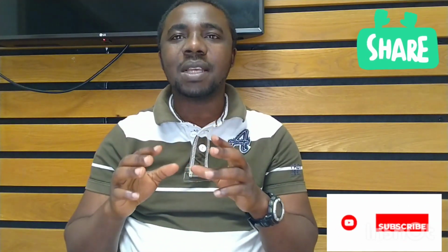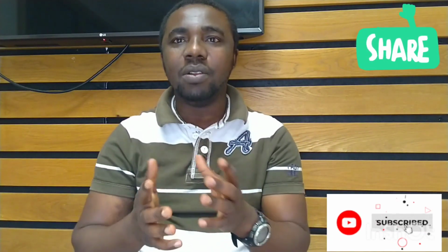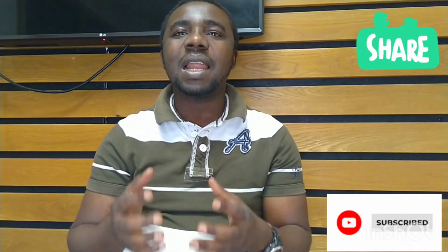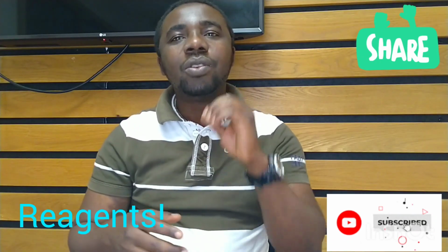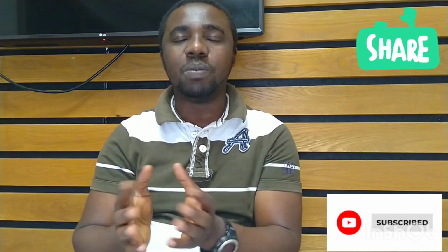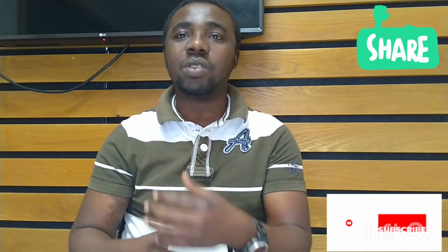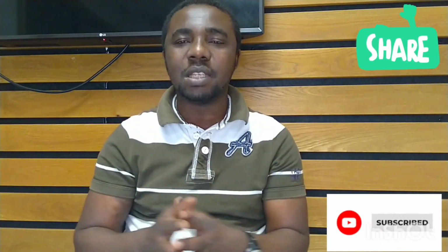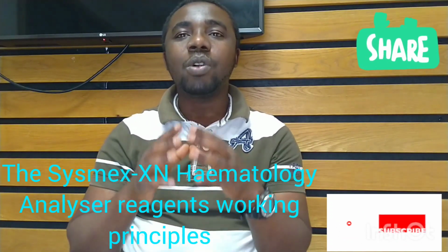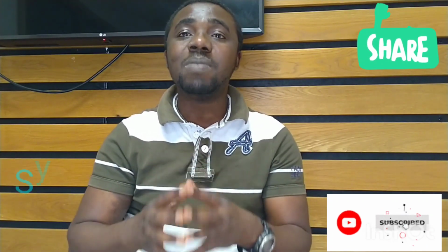But I want to say that those principles that we've mentioned have to do with how the analyzer gets the values, okay? But for the analyzer to get the values, a lot of things happen. Remember that these analyzers make use of reagents, and those reagents do a lot of things before the quantification value that you get, following the flow cytometry or impedance, based on aperture, as the case may be. So today we're going to be looking at the working principle of the analyzer reagent, and I'm going to be focusing on Sysmex XN line.